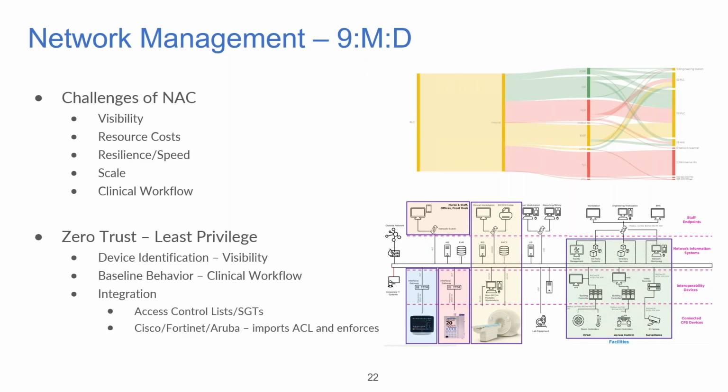And then you move into network management. Within the asset discovery and security tools, the ability to actually see what the network flow is for this device. You know, what's it communicating with? Should it be? Should it not be? So you can start getting into clinical care, and when you make your network segments, you say, here I've got little boxes around the patient monitor, these two devices need to talk. Over here, the MRI needs to talk with the PACS and the clinical engineering workstations.